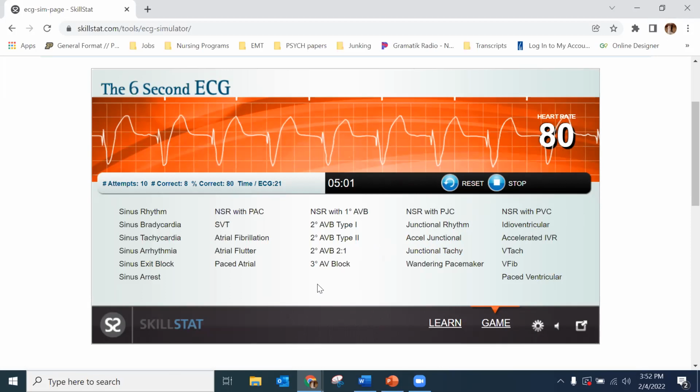This one, I think I know which one this is. Okay, here's the deal. This one is considered a paced ventricular rhythm. To me, that doesn't look prominent enough to be a pacing spike. I would question that because it's usually literally one straight line to indicate that your pacer fired. So I argue that this is a little weird looking. But what you do have is indication that they are being ventricular paced, because that pacing spike happens right before your QRS complex. But I don't think it's a good picture.